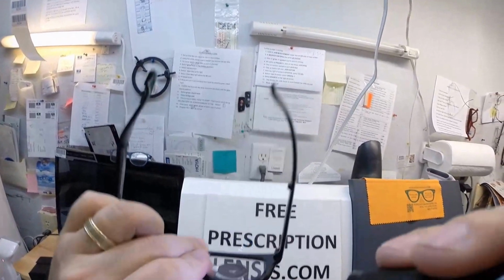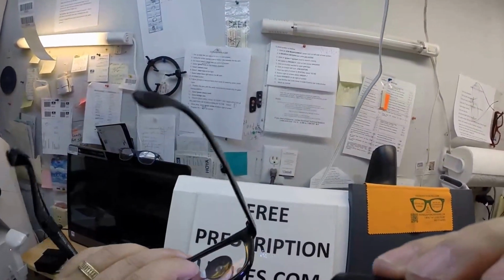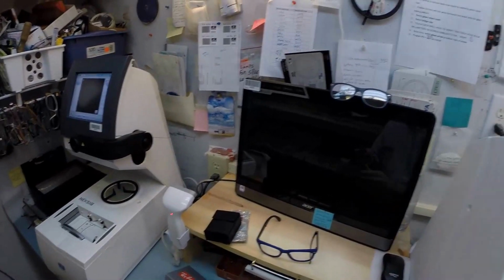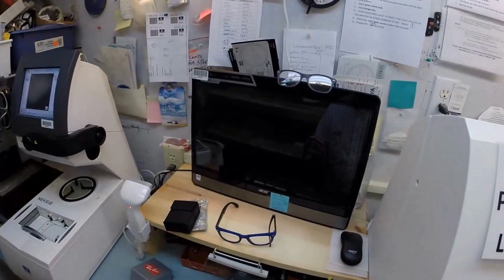And as I promised, you have no edge thickness showing whatsoever in this frame. Partly is because of your prescription, partly because I'm using the thinner, lighter weight, unbreakable lenses, and they're also aspheric, so you never have to worry about that. So I'm going to go ahead and pop the block off. That is no longer needed.